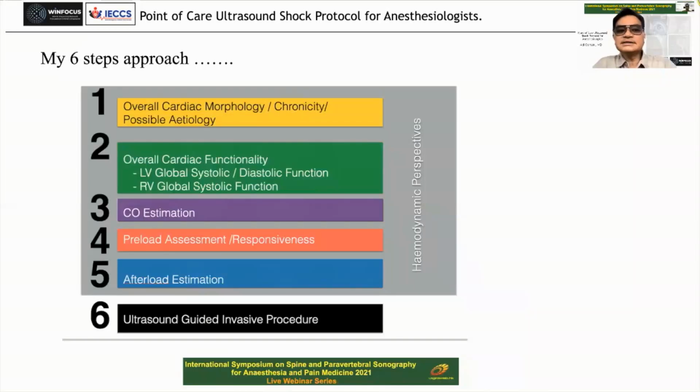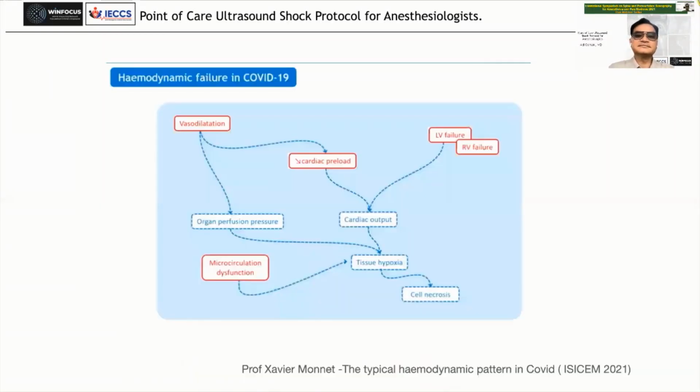And this is my 6-step approach in shock patients. I purposely divided it so that the first 5 look at the hemodynamic perspective, and the last is the usage of point of care ultrasound in guiding invasive procedures.